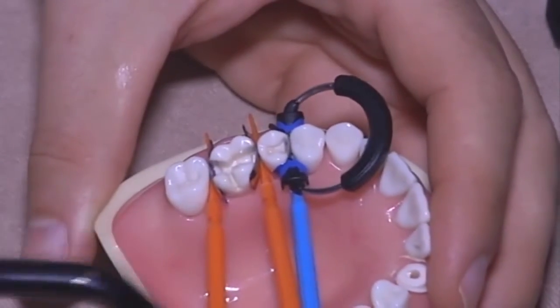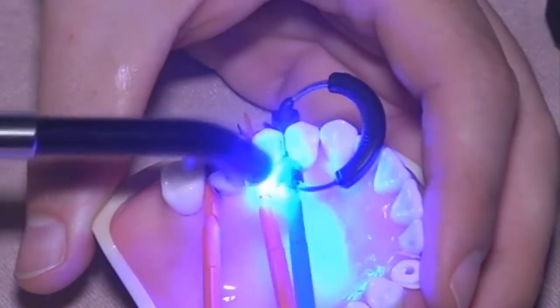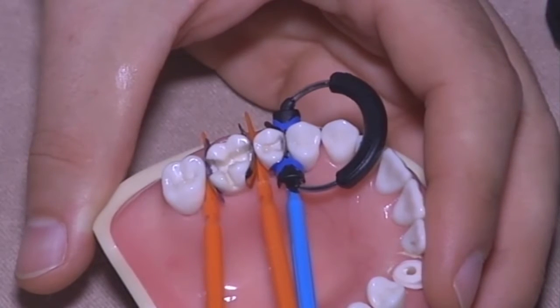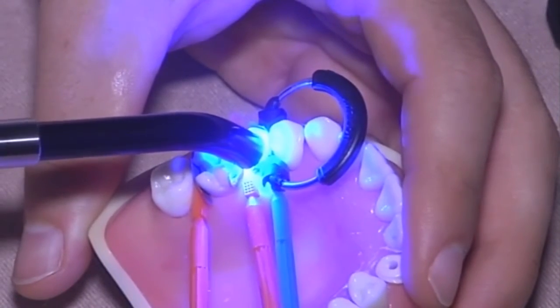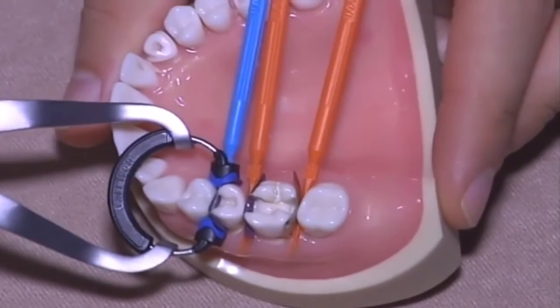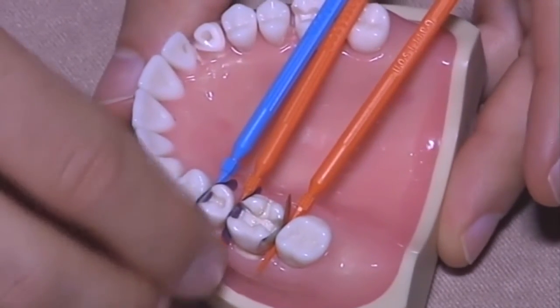Once you did it, I changed the program, I think. Okay. You light cure it, and then you can remove the ring. Technically, you can even remove everything.